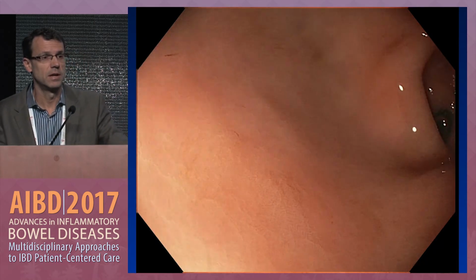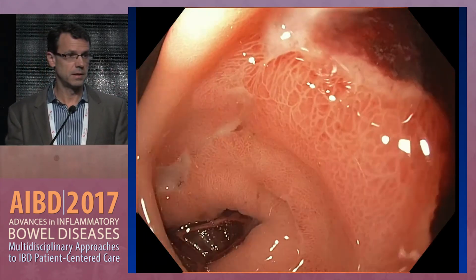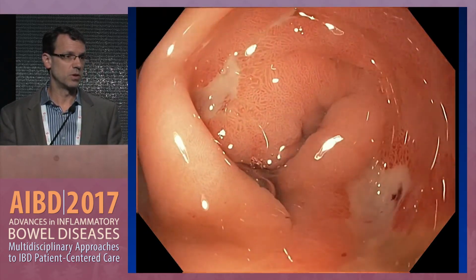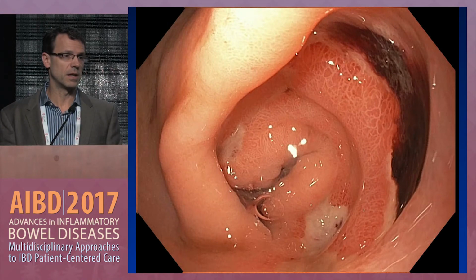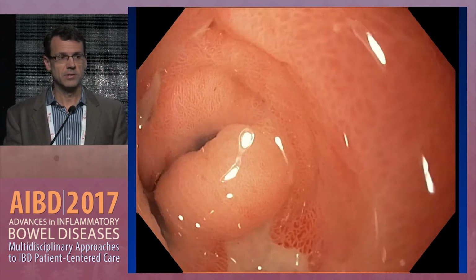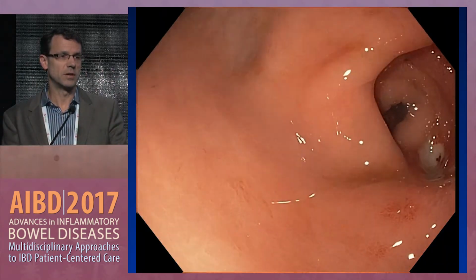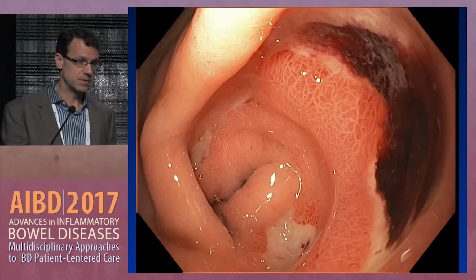So this is her endoscopy. So this is her antrum. She has multiple ulcers, one of which is enormous with a big clot on it. She was, not surprisingly, iron deficient anemic as well. So she has really terrible disease here, which was causing her a lot of symptoms.